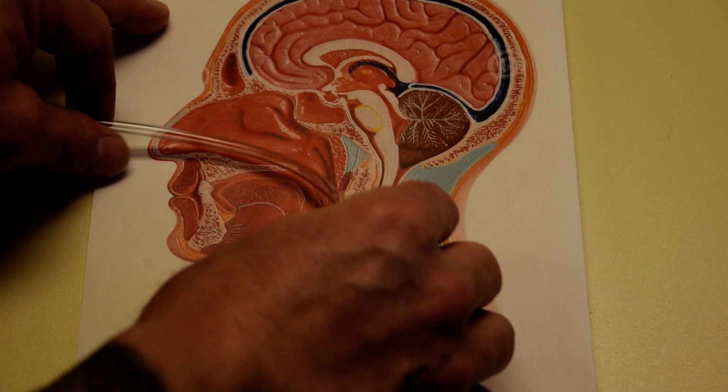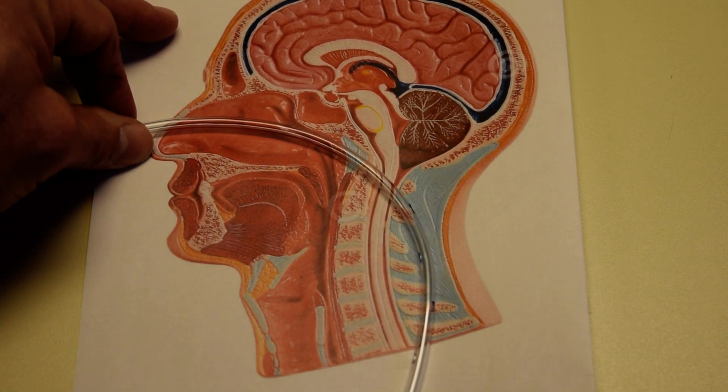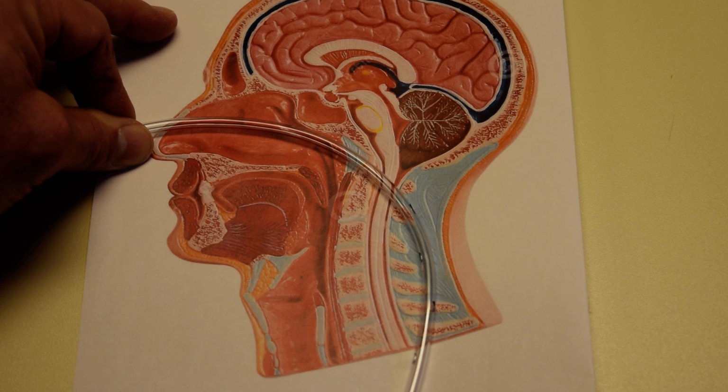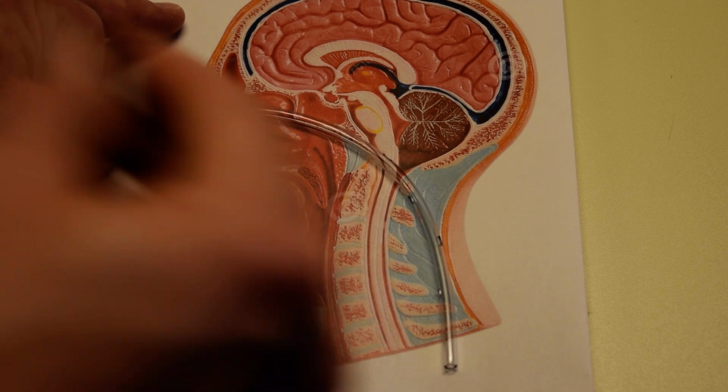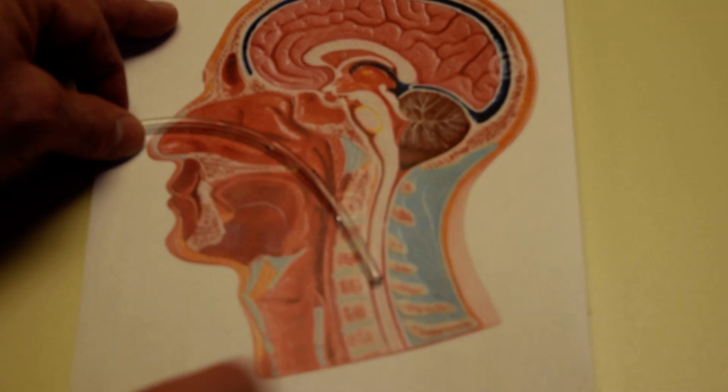For example, if you get to this point here and the patient starts coughing and choking and sputtering, don't pull it out. Stop at that point, give the patient a chance to recover if they can. And if they recover, then you say, are you good? Okay, is the tube down in your lungs, or where do you feel it is? And they may indicate that, no, it's in the wrong place. They'll shake their head, whatever. Then at that point, you may want to back it up. Don't have to pull it all the way out. You're going to want to back it up a little bit.